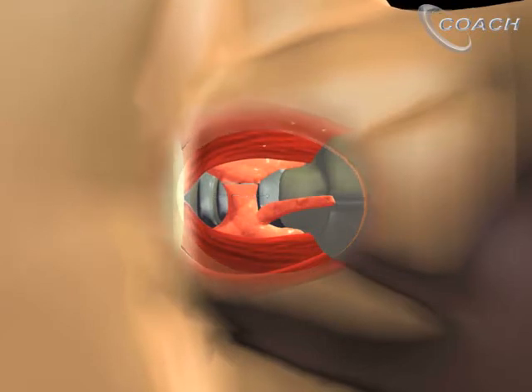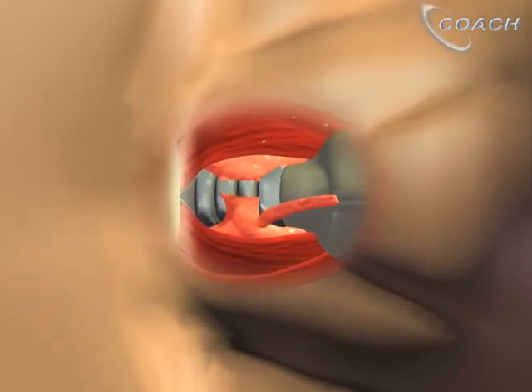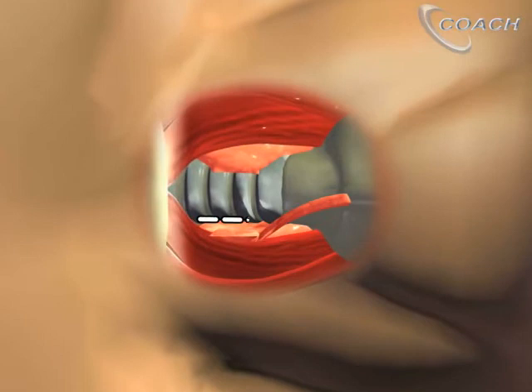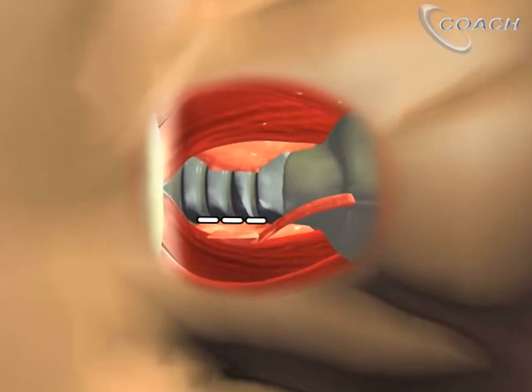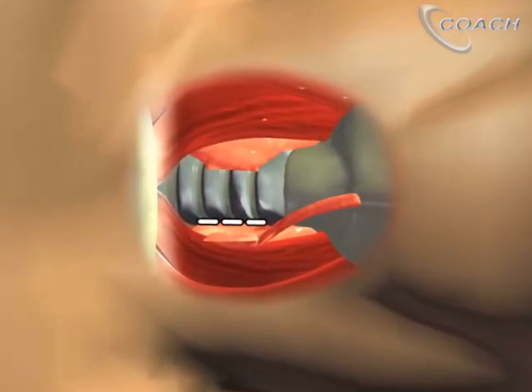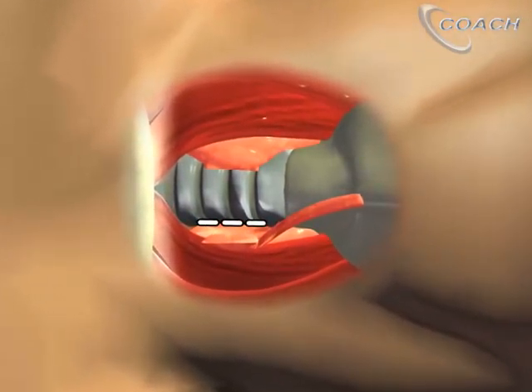Next we'll divide the tissue between the trachea and the thyroid, taking care not to go too posteriorly and certainly not past the middle of the trachea.